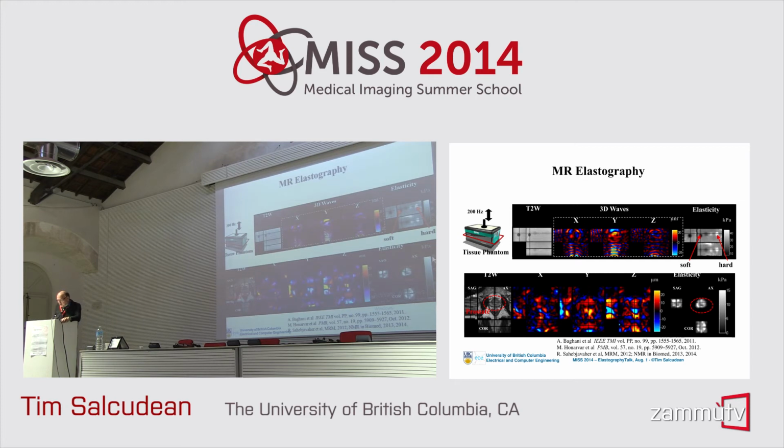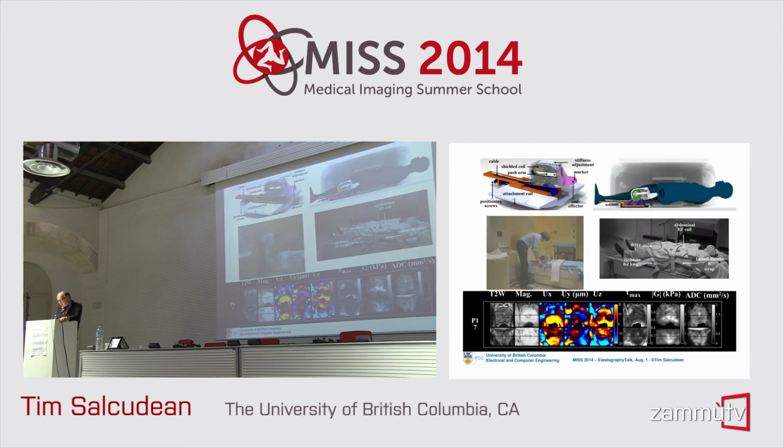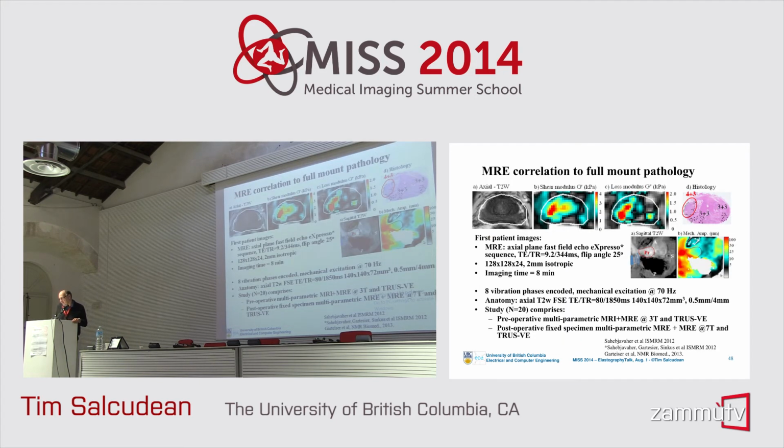Okay, so I also will show you some images of the prostate. These are waves propagating through the prostate. These waves are generated by a transperineal exciter. These correspond to the waves that are monitored by MR. The excitation that we use is transperineal. The subject stays inside the MR with the legs slightly spread apart. And what we have is a shaker which pushes against the perineum and sends waves.